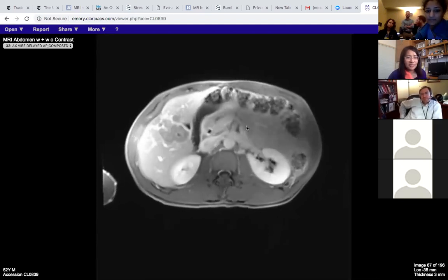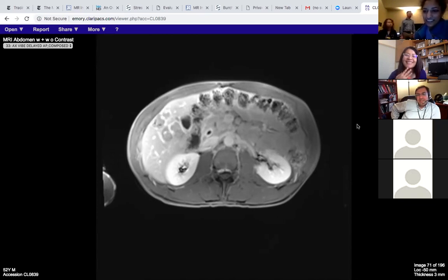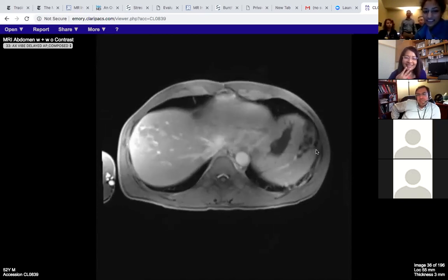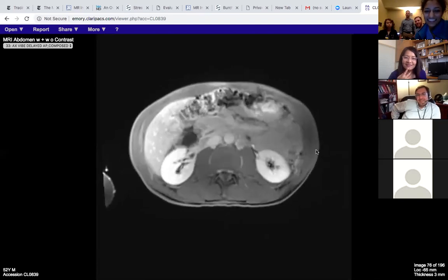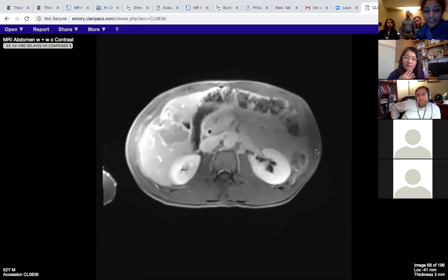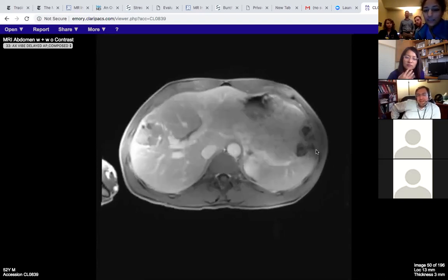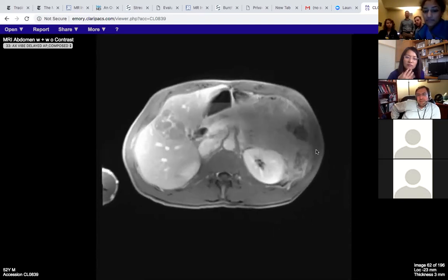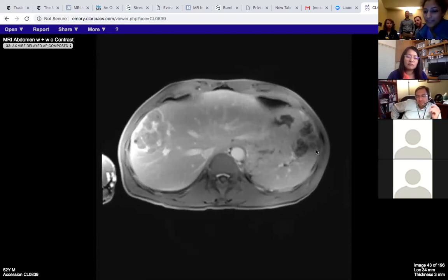I don't know that I would have added lymphoma to my differential. Now you will — it's one of those diagnoses, along with sarcoid, amyloid, lymphoma, and TB, that comes up in every single case where you're scratching your head. Knowing the patient had advanced HIV, and in retrospect seeing the lobulated appearance, vessels going through the lesion, and very low ADC, those features argue against simple infection because it looks like enhancing solid masses. It's much more solid than you'd expect for an abscess, though atypical abscesses exist, so you could put both in — ultimately it has to be biopsied.